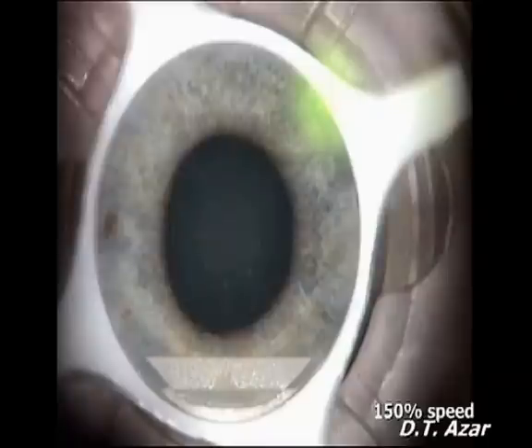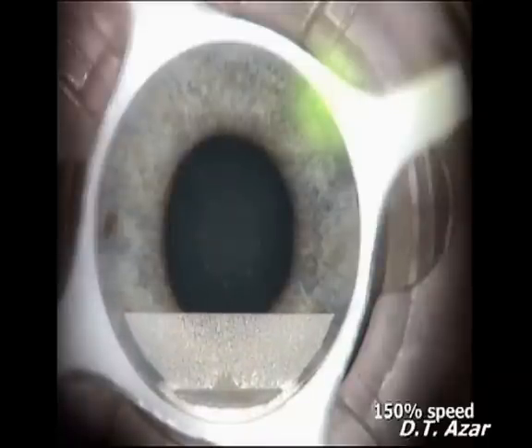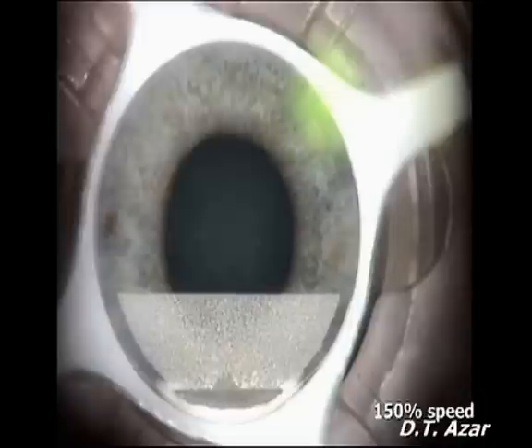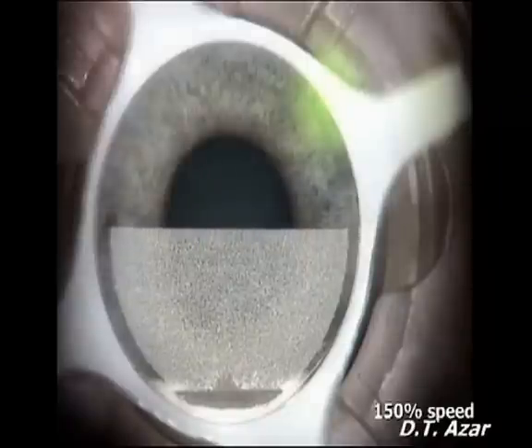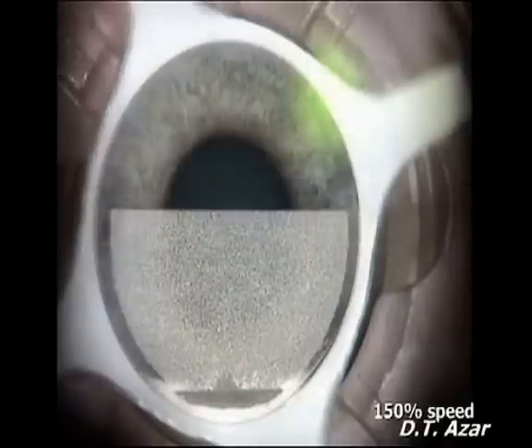The laser begins by first creating a pocket in the superior cornea that will collect the gases produced by the ablation. Then the lamellar dissection is produced by laser pulses delivered in a raster pattern from a superior to inferior direction.